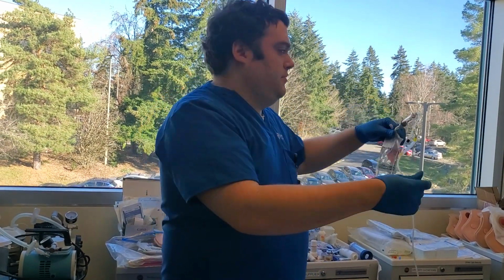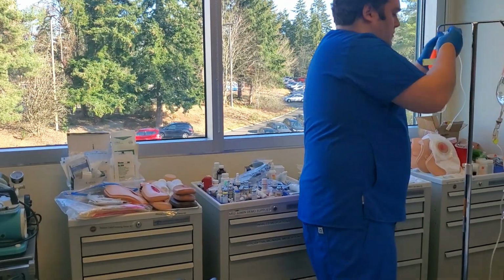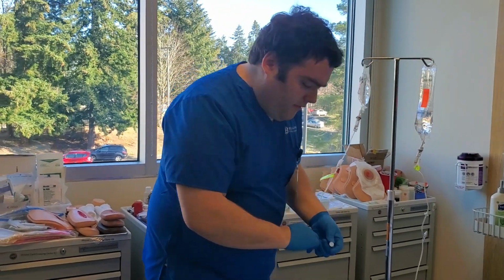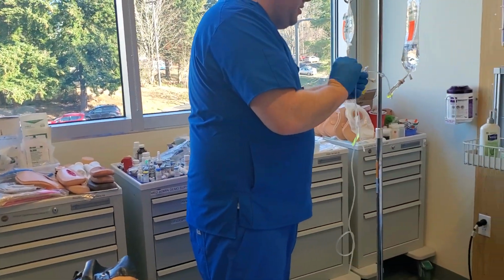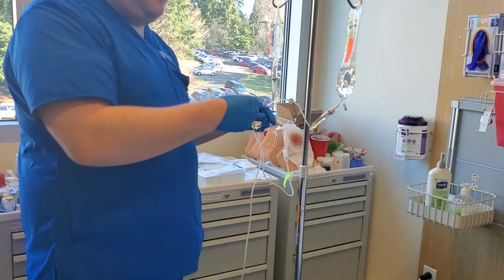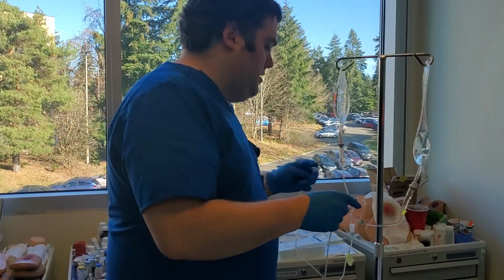Okay, so I'll make sure not to touch. So go ahead and put this up here. We will go ahead and we have also, if we haven't done it, we'll pretend like this. Also just grab this. 15 seconds, 5 seconds, air dry, and then so we'll check to see.